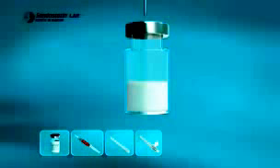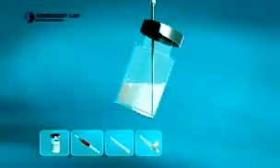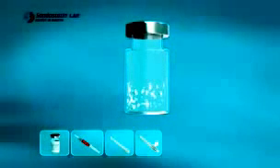Immediately reinsert the needle through the rubber stopper, and then with the bevel down and the vial tipped at an approximately 45-degree angle, slowly draw the contents of the vial into the syringe. Do not invert the vial when filling the syringe, as this may affect the amount withdrawn. It is normal for a small amount of residual suspension to remain on the walls and bottom of the vial. This is a calculated overfill.